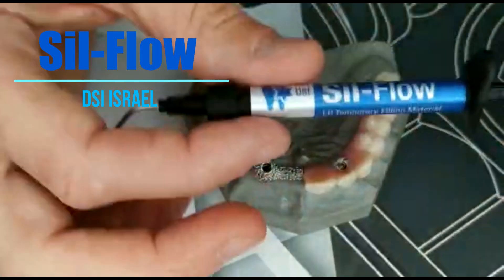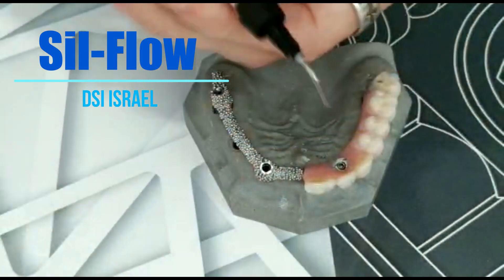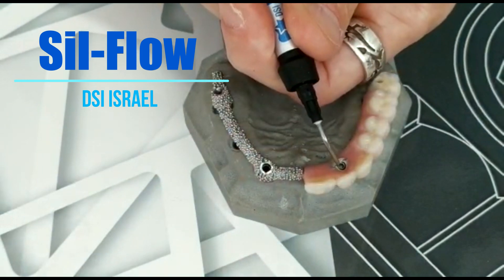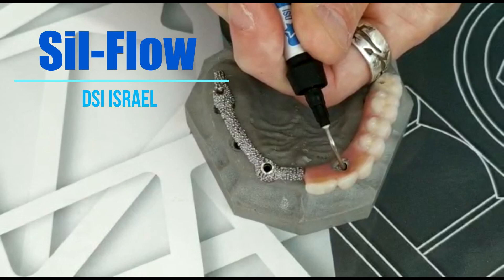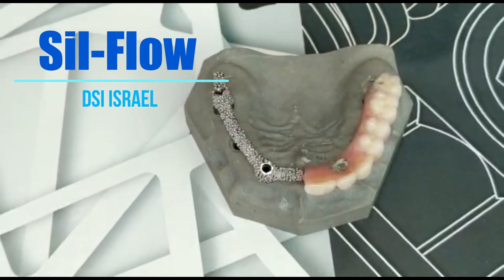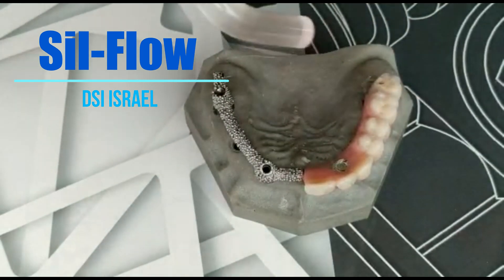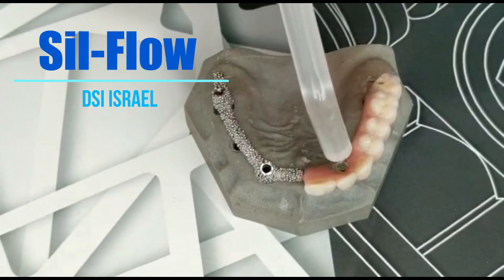This is a light-cure material. No need to isolate the screw — just put the material on the screw directly. All we need is just 20 seconds of light curing, and that's all.